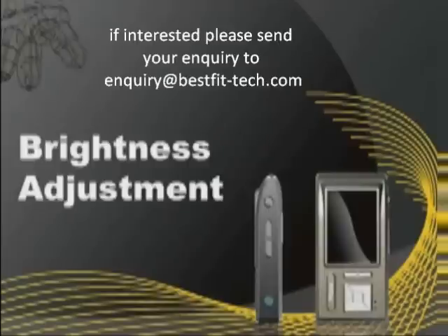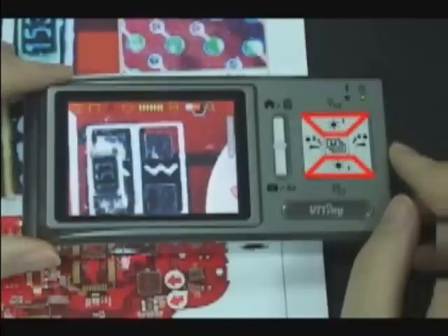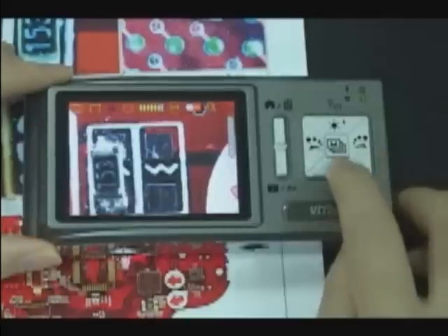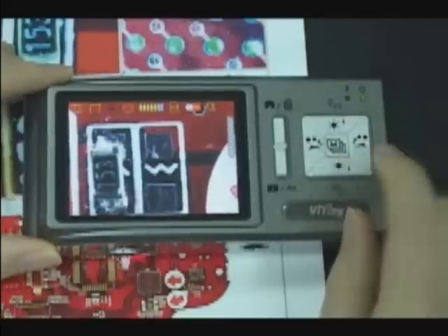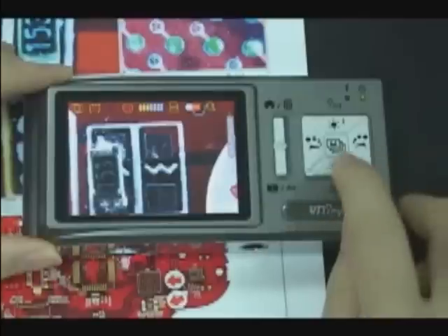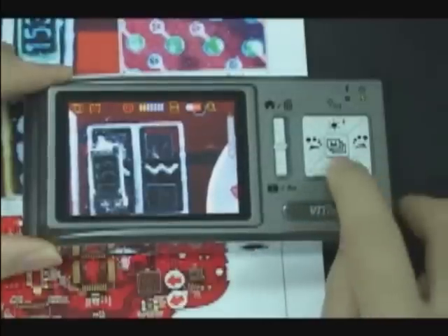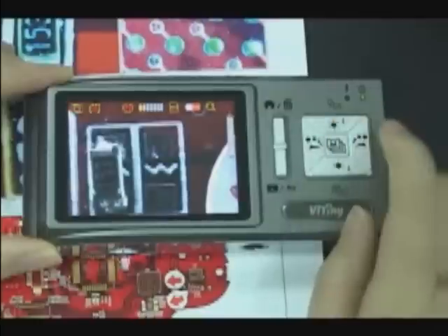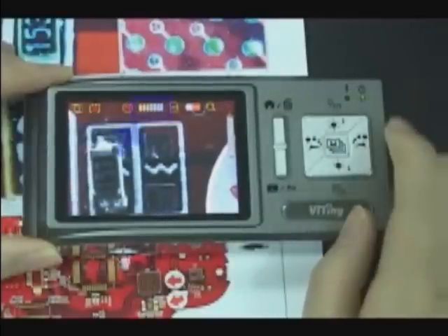Brightness adjustment. Press the up and down buttons to adjust brightness. On the top of the screen, you can see the brightness icon.